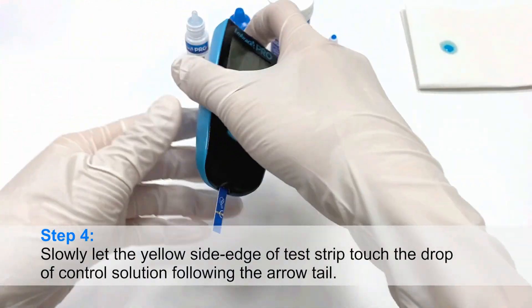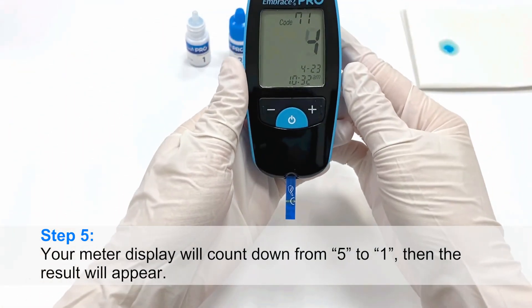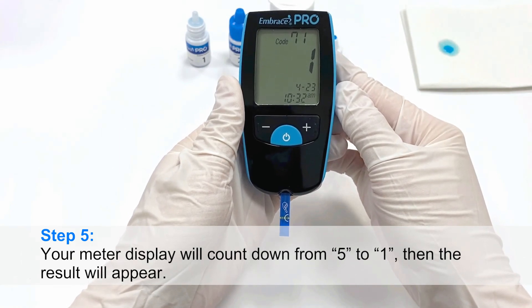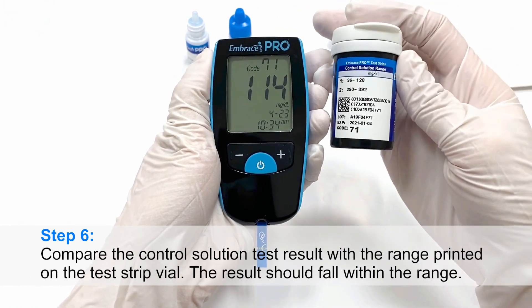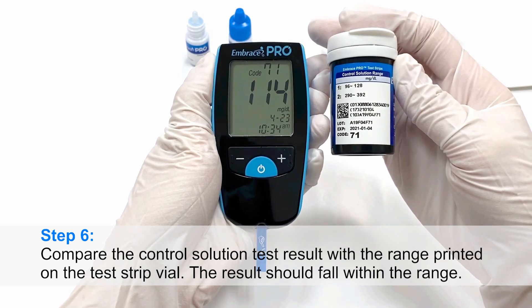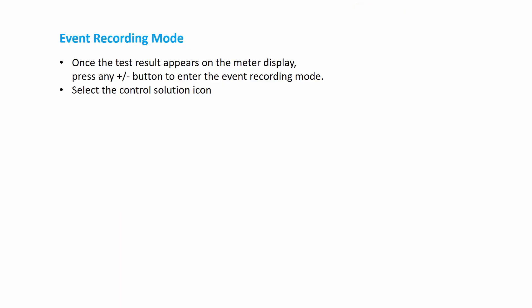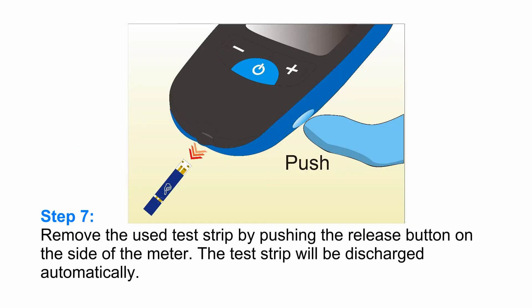Step 4: Slowly let the yellow side edge of the test strip touch the drop of control solution, following the arrow tail. Step 5: Your meter display will count down from 5 to 1, then the result will appear. Step 6: Compare the control solution test result with the range printed on the test strip vial. The result should fall within the range. Step 7: Remove the used test strip by pushing the release button on the side of the meter. The test strip will be discharged automatically.